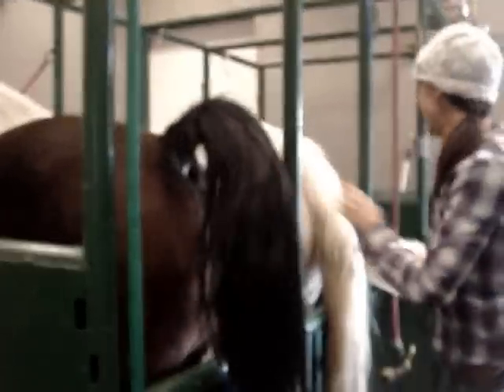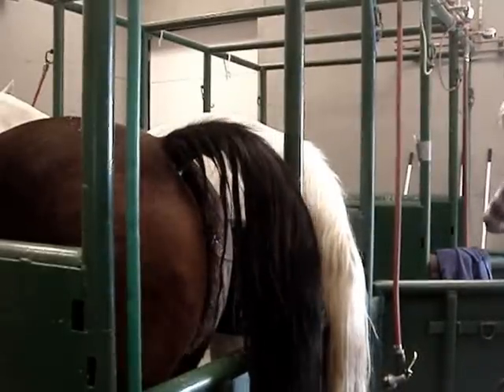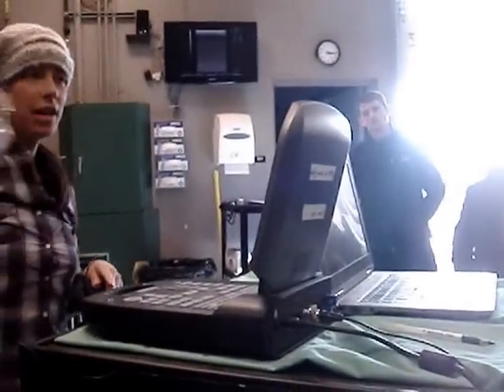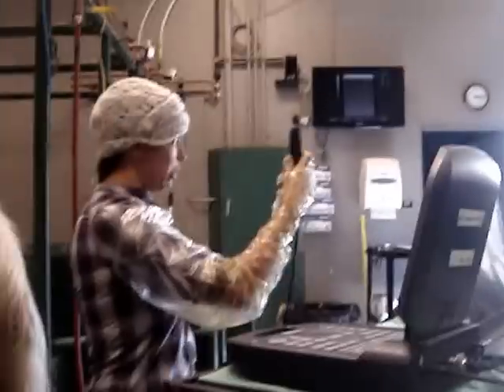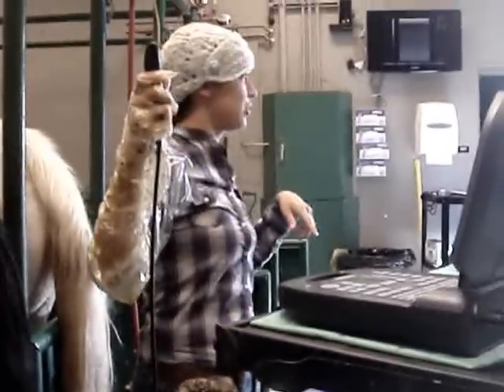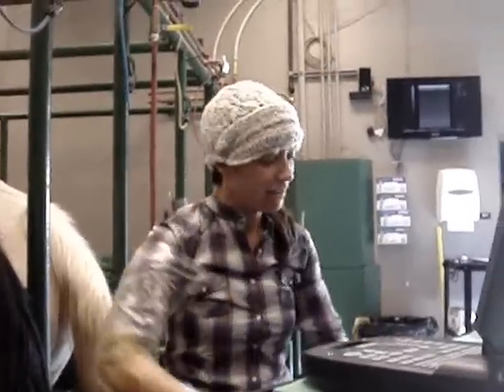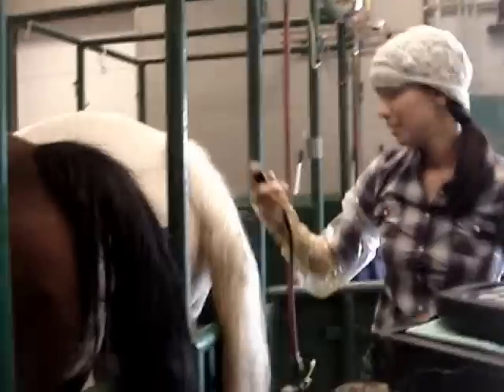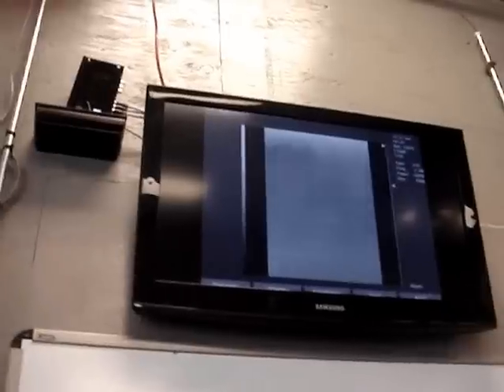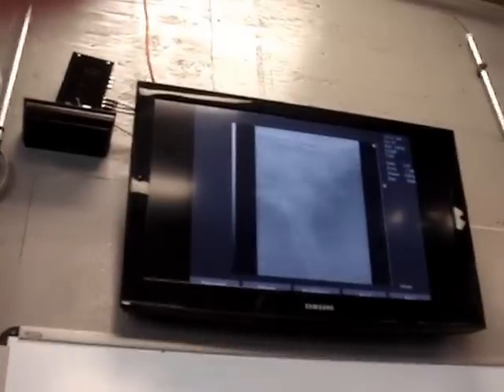Alright. So once I've gotten her all cleaned out, as clean as she's going to be, I'm going to ultrasound her. This is my ultrasound probe here. It's got the viewing part of the probe on the bottom. And everything that I see, you guys are going to be able to see up on those television screens there, so you don't have to crowd around me and look at the screen that I'm looking at. Alright, so we're going in.